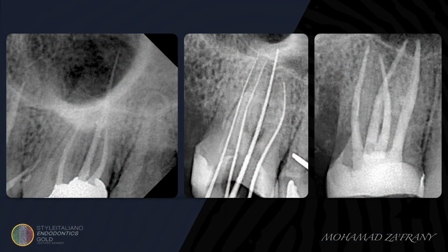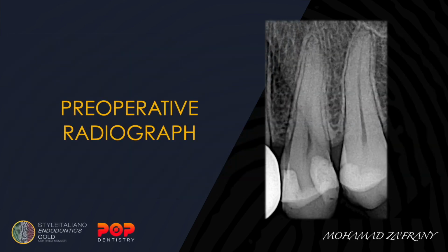In the palatal root, you can see a filled island between the two palatal canals, thanks to the passive hydraulic condensation using bioceramic sealer to allow sufficient 3D obturation of the root canal space. This is the last case for today. Root canal treatment of tooth number 24 with symptomatic irreversible pulpitis and normal periapical area.